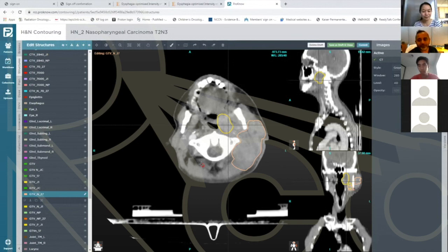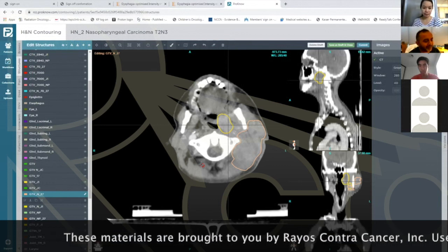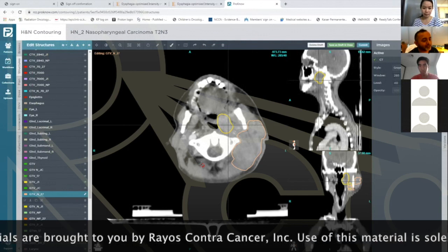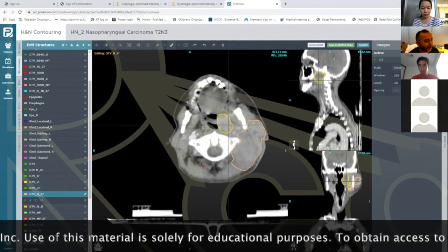And then the question would have come, right? So what if you treated this patient with induction chemotherapy and now there's no nodal disease in that parotid gland, right? Could certainly happen. Say the person has a great response to induction chemo and that nodal disease really involutes. I would say that you still have to treat that parotid gland, right? So then I think the question becomes, what dose are you going to treat it to? And I will say that I think that's really the art.